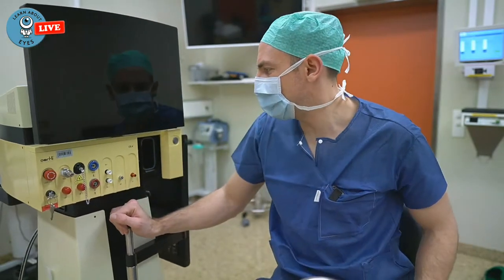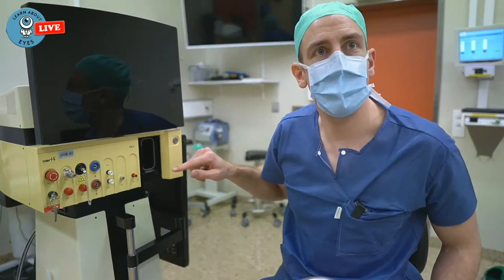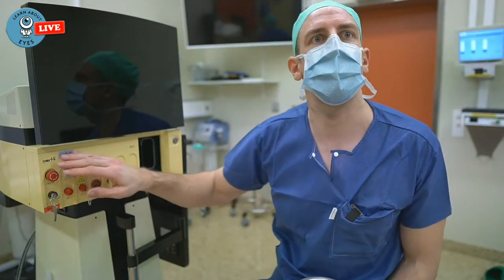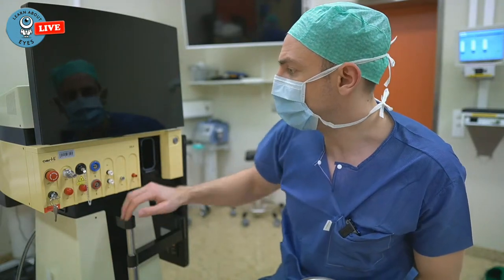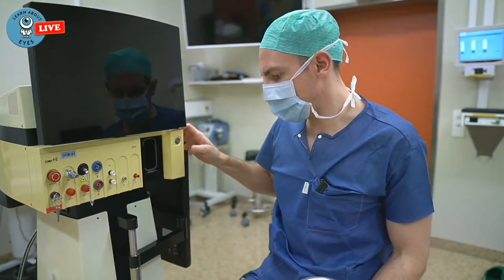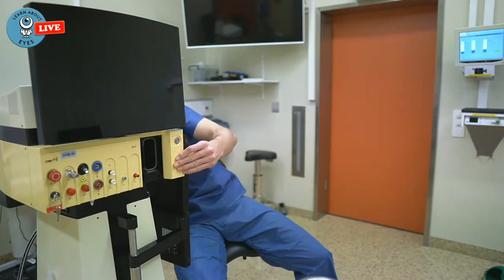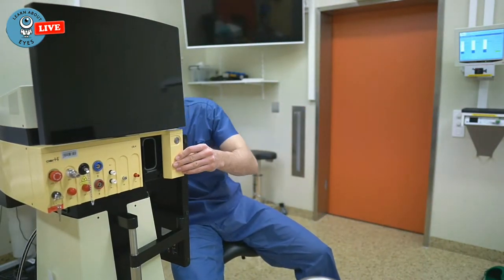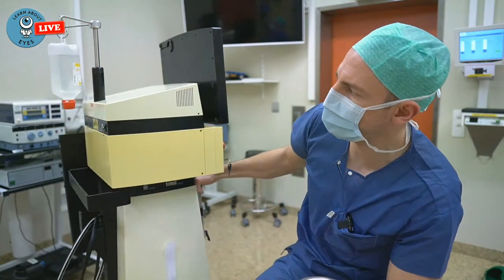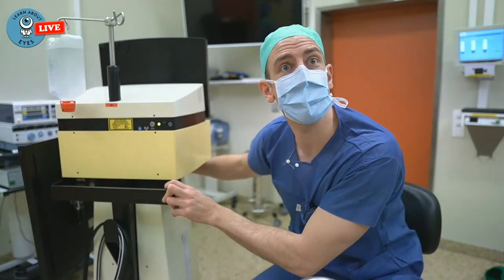All right, so this is the Oertli OS4, I think. What I've done so far is to plug it into the wall mount and to plug in the air supply into the wall. And then we need to figure out how to turn it on. And there is a flip switch on the back here, obviously.